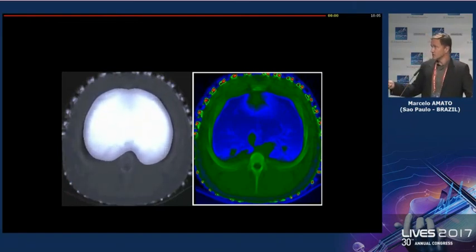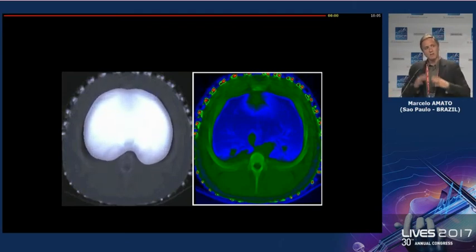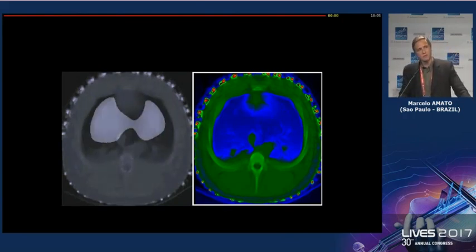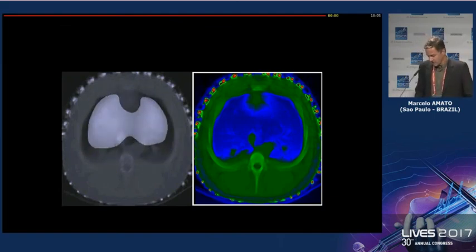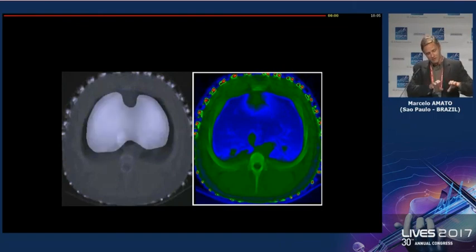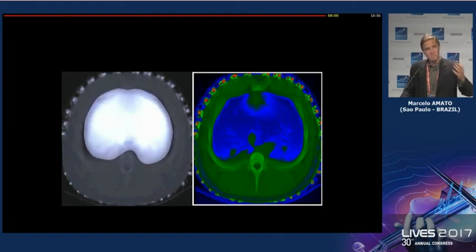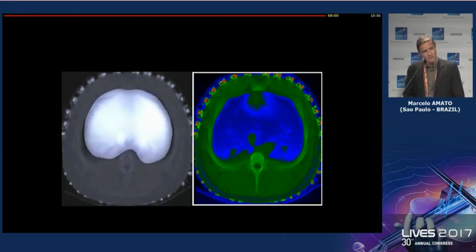You are just using the anatomical atlas to regularize the image. So I believe that with this approach, we can get rid of these border effects that we still have with EIT. But this is something still for the future. What we observed is that even with these constraints of spatial resolution, at the bedside we are missing so much information that it's already useful.